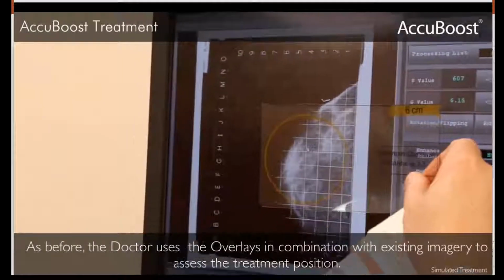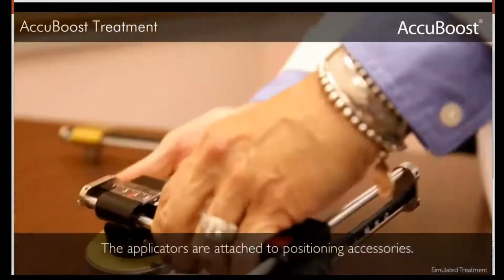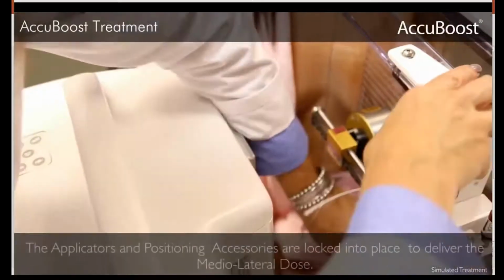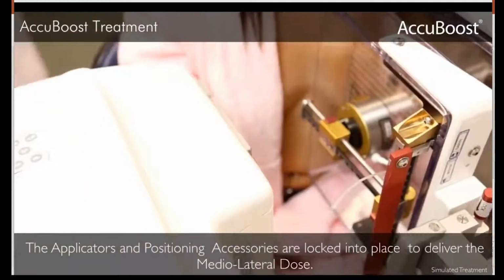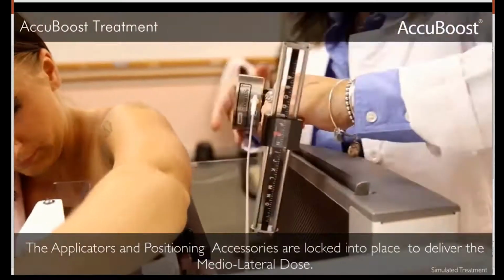So again, the process here is repeated. The targeting grid is evaluated. The applicator size, shape, and position is selected, and again, the process is repeated here with the applicators being snapped into place.